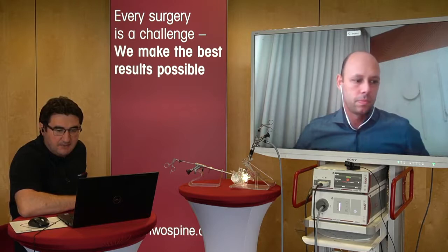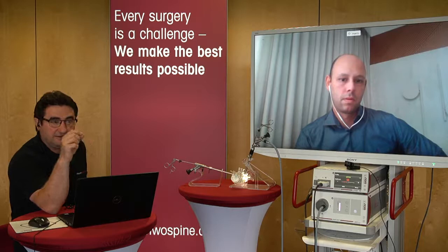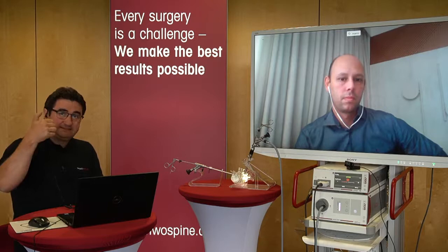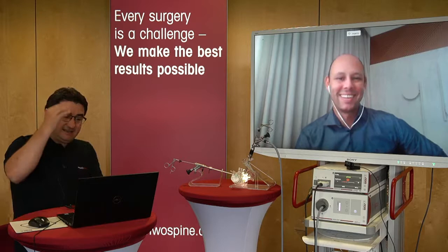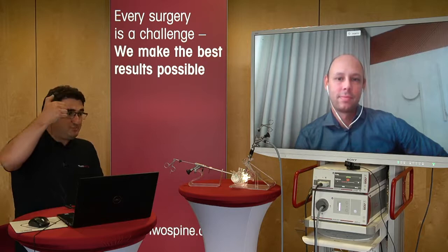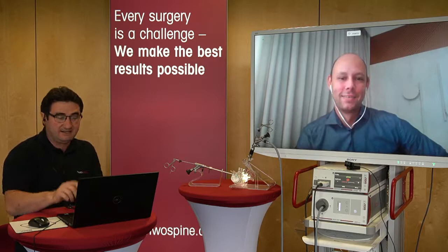Maybe there is a trick here. If you want to put a steroid or some material after the surgery, there is a small trick I can recommend. You can take out the scope and leave the sleeve inside the spine, and then put the dilator in, but please keep the openings of the dilator open, and let the water go out. Then you can put the steroid or marcaine or lidocaine. Then you can push this dilator into the spine, but please close the openings of the dilator with your thumb, and then you can push the material inside the spinal canal. This is a small trick. Maybe you do it. Yes, of course. Okay.